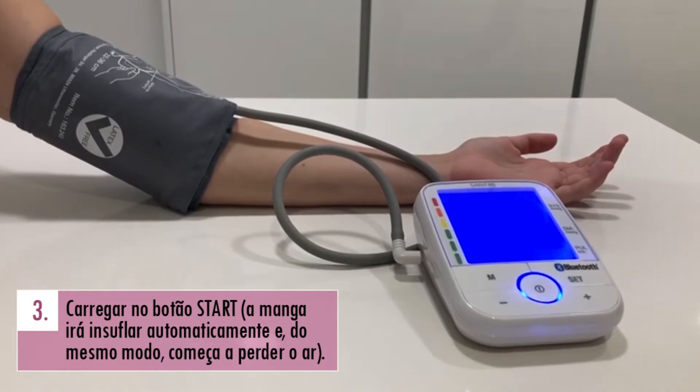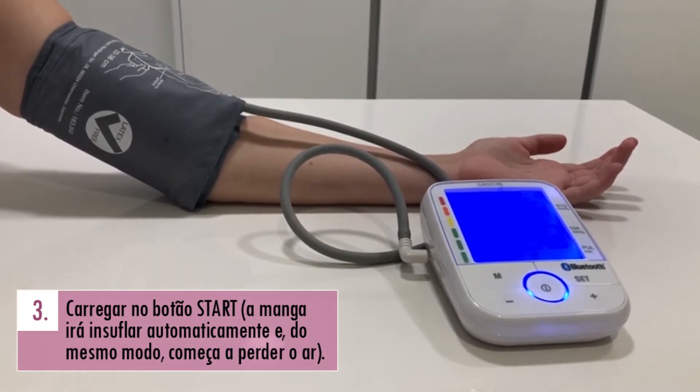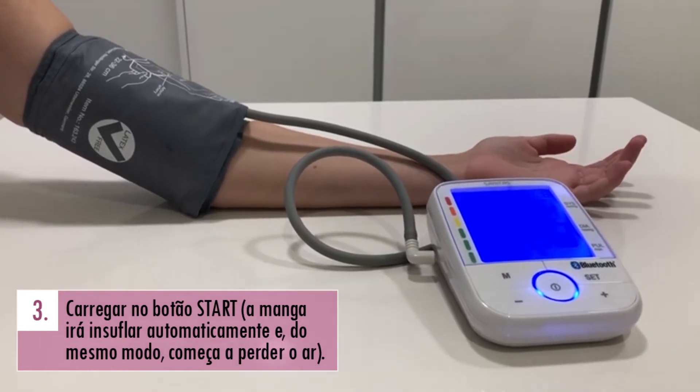Ao carregar no botão Start, a manga irá insuflar automaticamente e, no fim, começar a perder o ar também automaticamente.